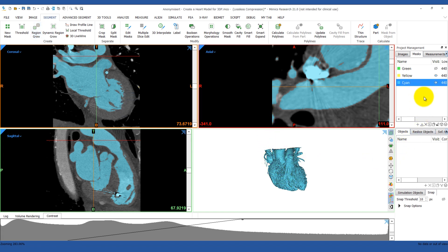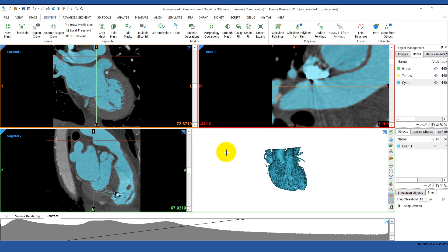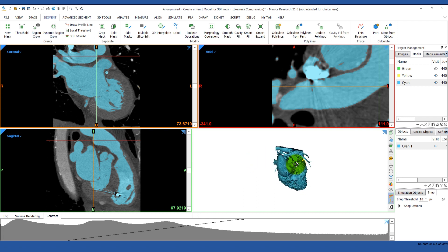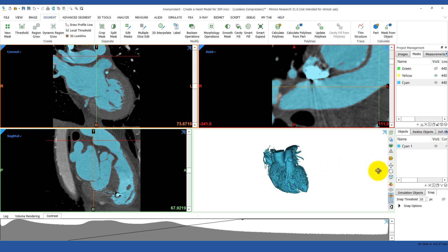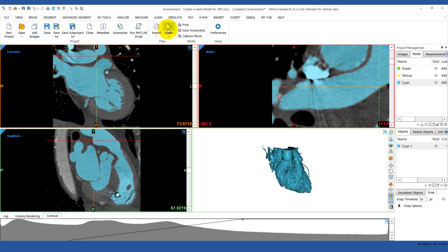Once you're happy with your segmentation, the next step is to calculate a 3D object. Make sure that you select optimal quality and the right mask. Check that the 3D model has no errors and everything looks good. If you see something that's wrong, you can always go back to your mask segmentation, edit it again, and recalculate the 3D object. The next step is to export this out to 3-matic.